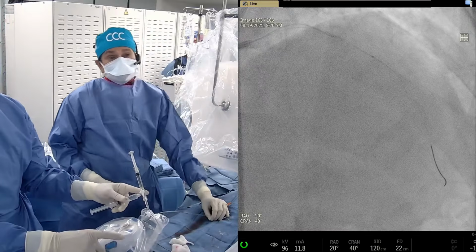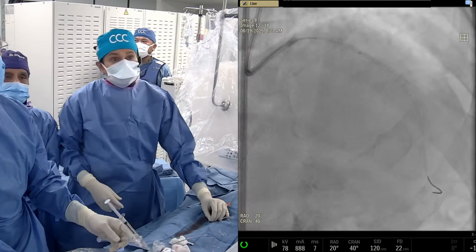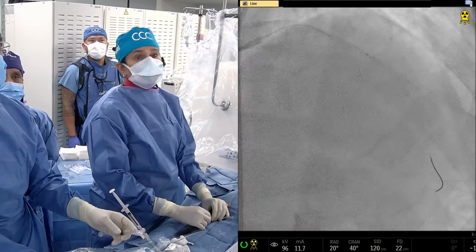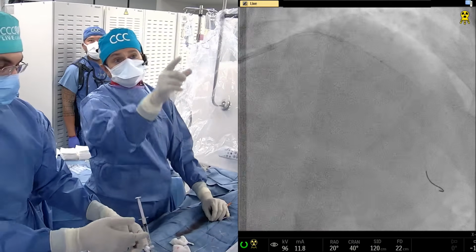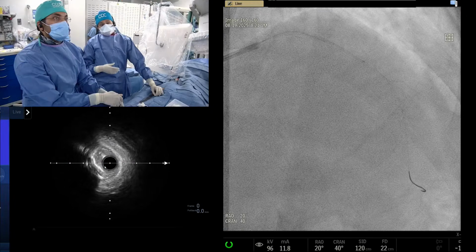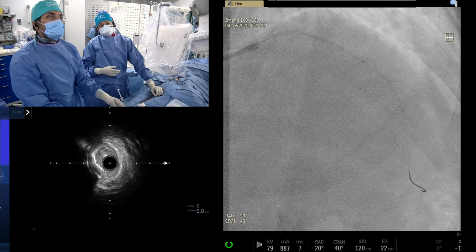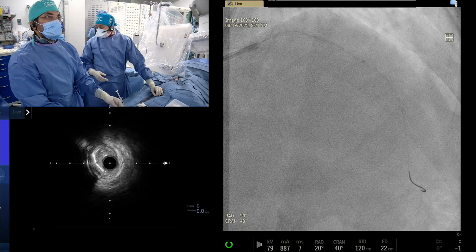Okay, look at it. There's no calcium and significant disease. It's not going further. It's a more proximal part. Yeah, I'm trying to go in, but yeah, I see eccentric. Right? Yeah, there is calcium. There is calcium. But not even one quadrant. No. Yeah. No, most of it is. Look at the calcium. It is between like 6 and 5. Yeah, and it looks like it's protruding a little bit inside. Maybe you can call it a calcified nodule. Not like 180 plus, but there is a calcified nodule, an eccentric calcified nodule in the proximal. It's only one quadrant.